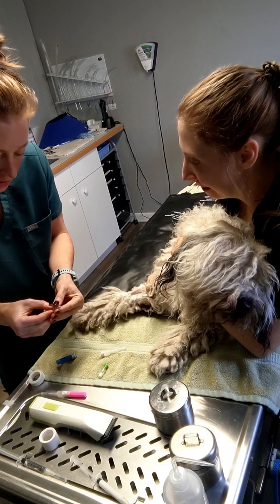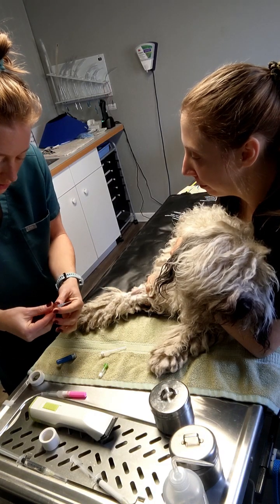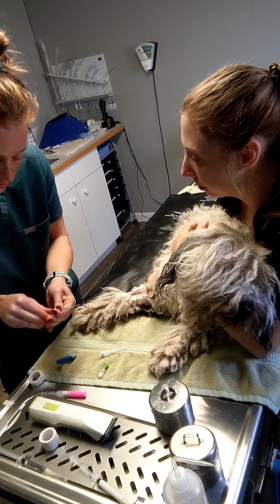Okay, so with the catheter, I just want to make sure each piece is able to be adjusted before I place it.